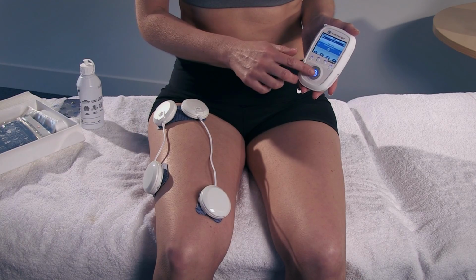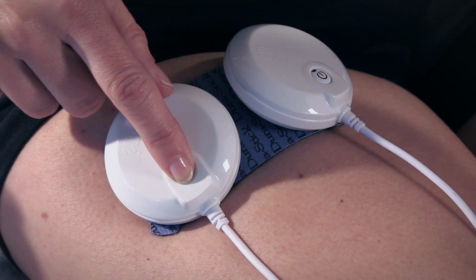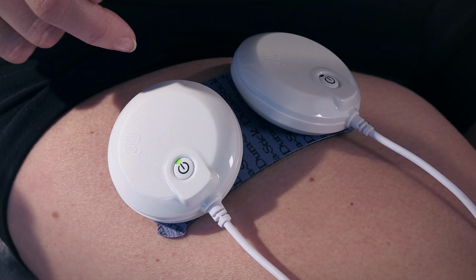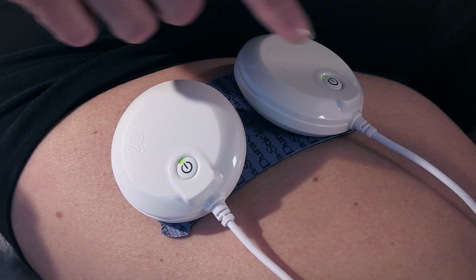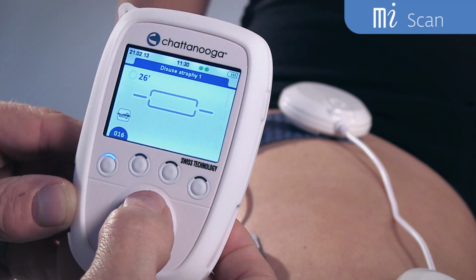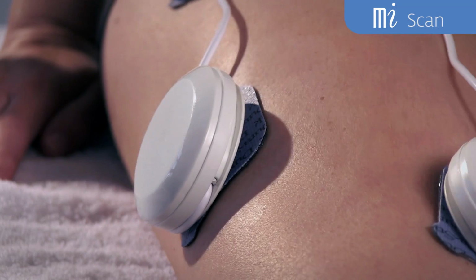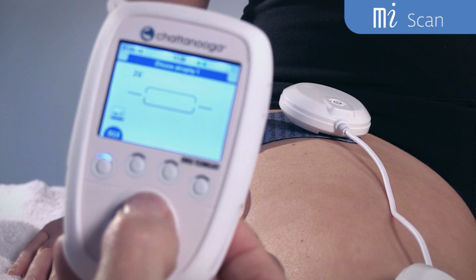Once the electrodes are in place and the desired program has been selected, the pods can be switched on. Pressing start on the control unit commences an MI scan. Scanning the muscle ensures that the optimal pulse width is selected for any muscle.